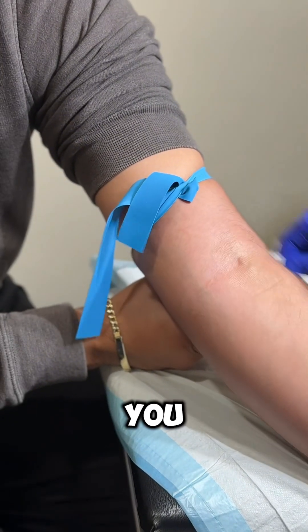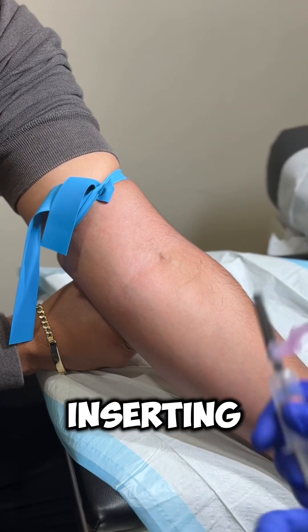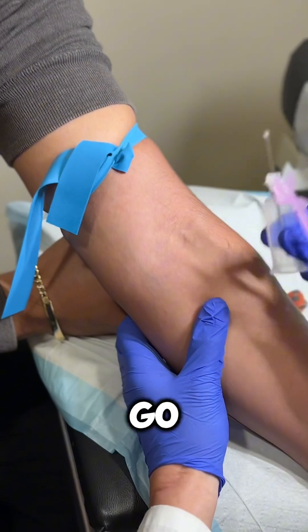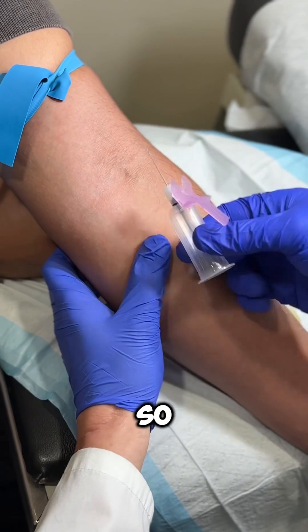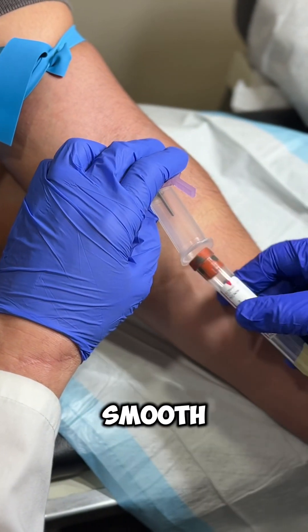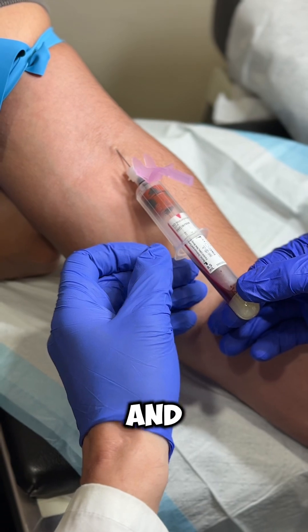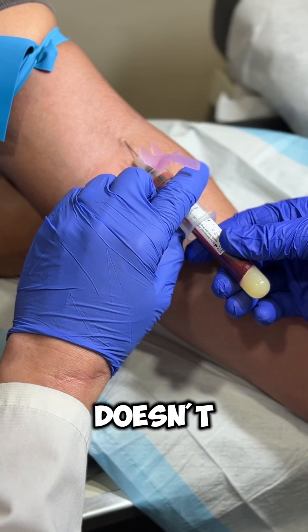If you touch it you clean it again. Some people like doing this on insertion — I like placing it right next to the vein and tapping the skin so I know the vein is right there. I go in gently, supporting my hand with my fingers. It goes in very nice and smooth. You just have to support the vein. Some people move the needle in and out — you can instead support it with your hands so the needle doesn't move, because movement is going to be very uncomfortable.